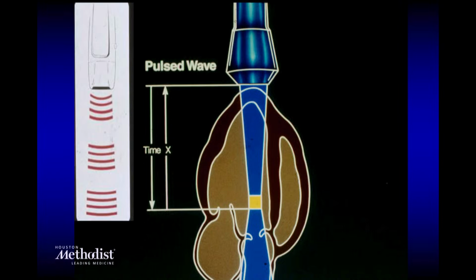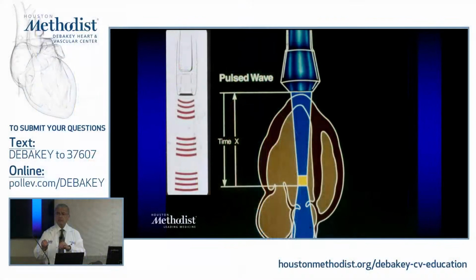Pulse Doppler, how do you do this? Pulse Doppler, I'm interested in the velocity at that site, let's say in the LV outflow tract. How do I do it? Well, I send a little burst, a little packet. You remember that packet? I send a packet, which is 3 megahertz, let's say. I send it, but I'm interested in that yellow area only.